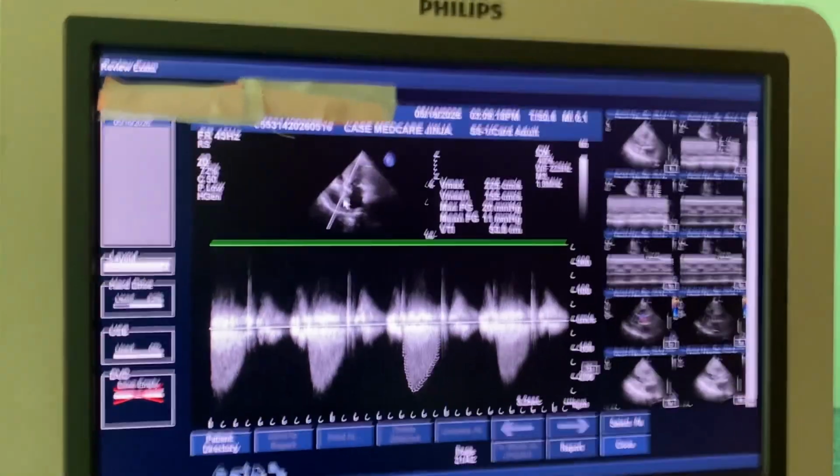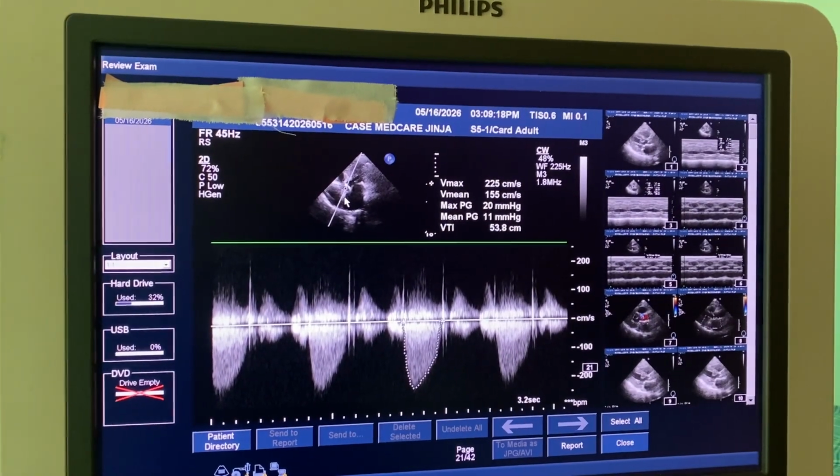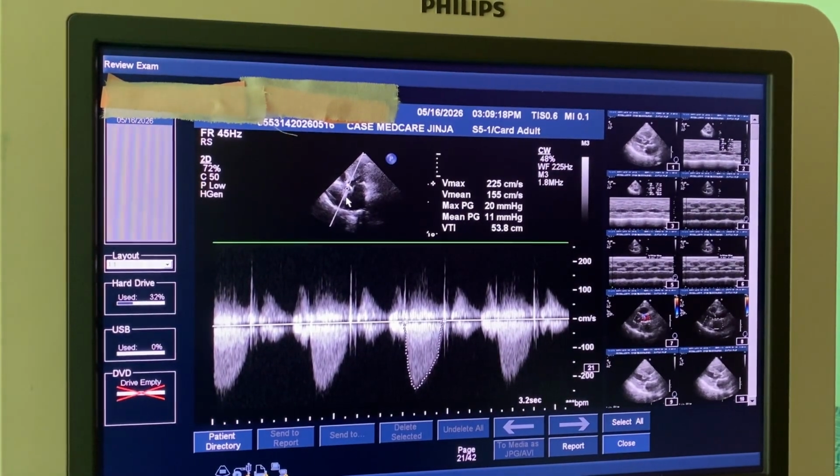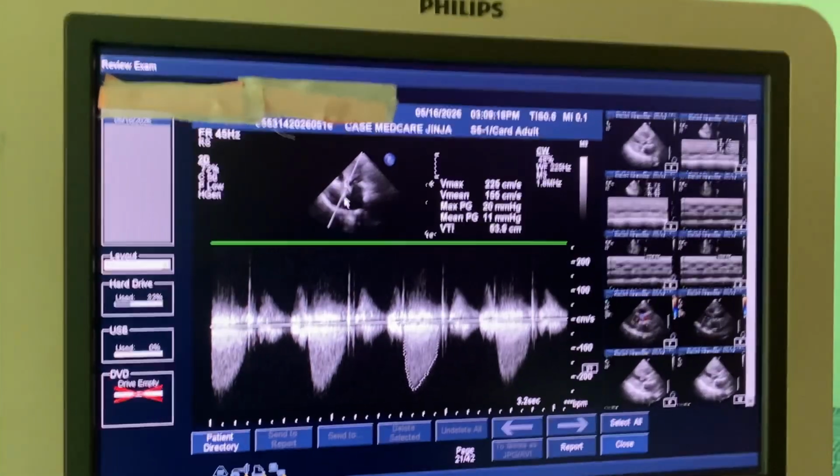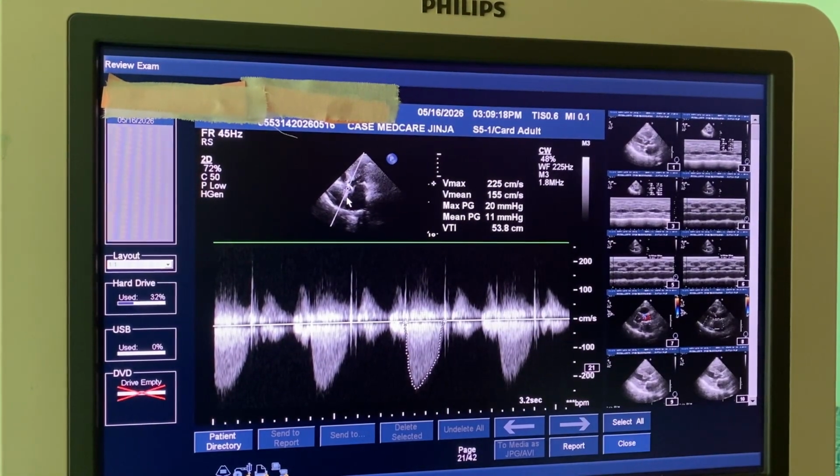Less than 0.25, it is severe. So first is telling us mild, next is telling us severe, last is telling us moderate. So now which is which? Don't we go with moderate? Huh? Why are you going with moderate? It is the mean. It's the mean of mean.